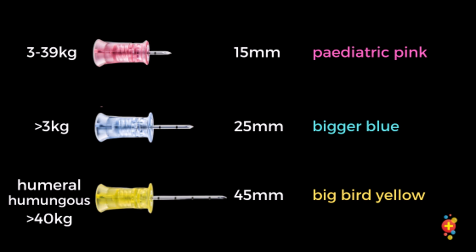Contraindications to intraosseous cannulation include infection at the intended puncture site, fracture of the bone, which is a relative contraindication, not for shock, only for resuscitation, and also failed intraosseous needle puncture on the same bone. So, if there is infection at the intended puncture site and a failed intraosseous needle on the same bone, that's a contraindication. Fracture of the bone is a relative contraindication.